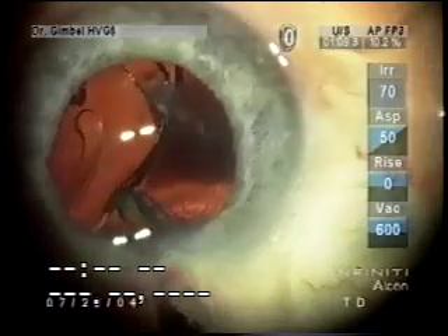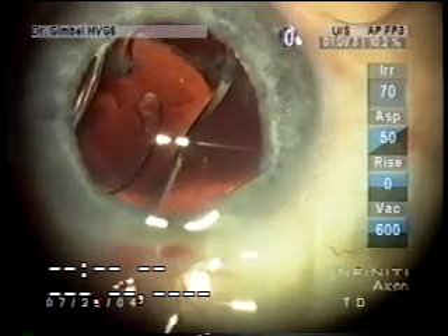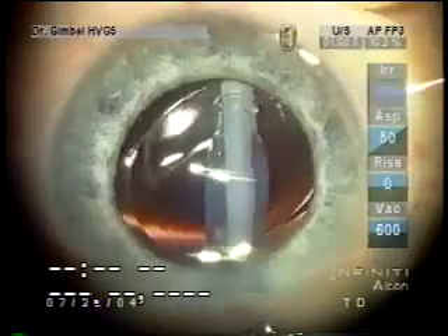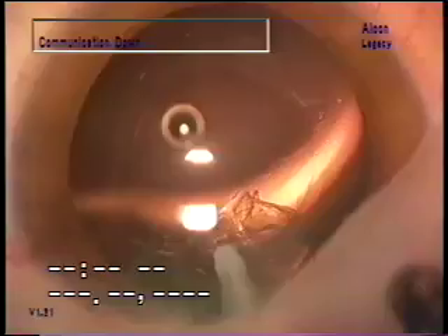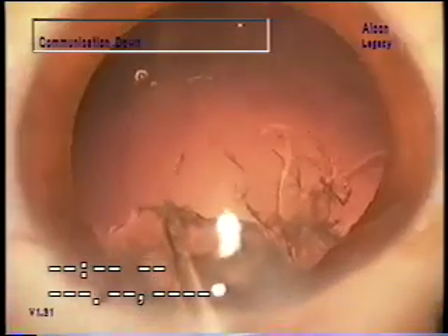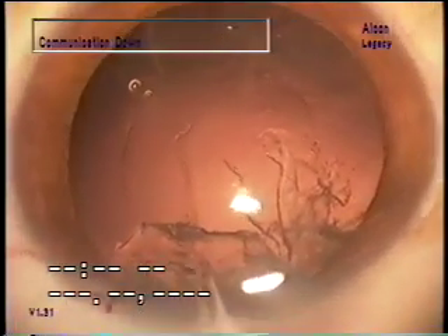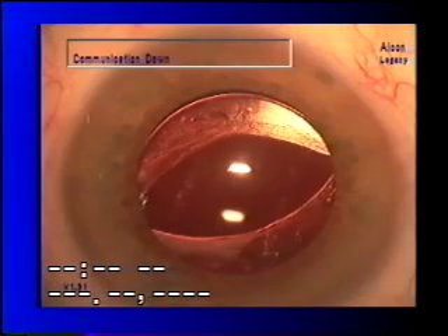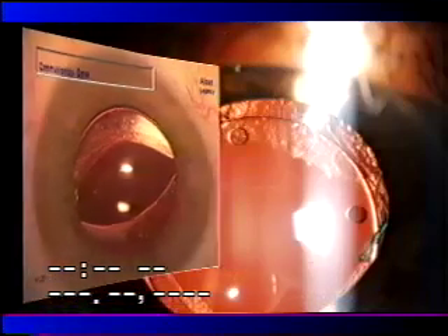"It's in the bag" is an expression we often use to express confidence in an outcome. In the bag is always our goal in cataract and refractive lens exchange surgery for the confidence of long-term stability and centration of the intraocular lens. There are many situations that demand sulcus placement rather than in the bag, such as anterior or posterior capsule tears. But standard IOLs placed in the sulcus may be unstable because the haptics are too short for the sulcus diameter, potentially resulting in pigment, blood cells, chronic inflammation, and glaucoma. I'd like to describe a technique called optic capture to stabilize lenses placed in the sulcus, or even lenses in the bag that are unstable because the bag has lost its integrity.